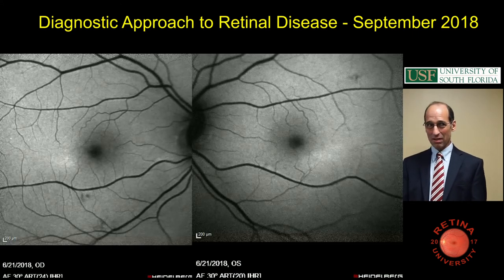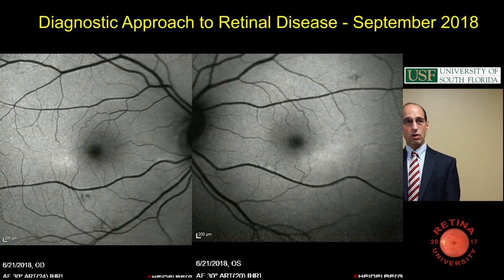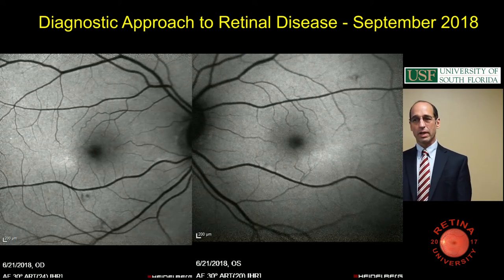Plaquenil's subtle. Did you stop it for this? Oh, yeah, absolutely. But the OCT would have shown more striking changes. The OCT would have definitely shown outer retinal problems, because the autofluorescence is a little bit late.